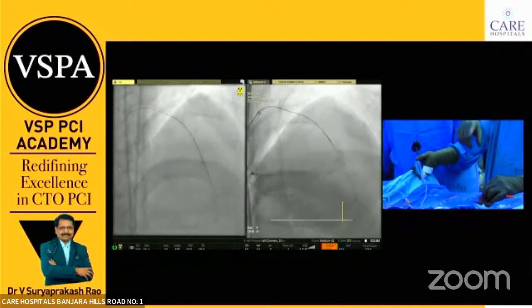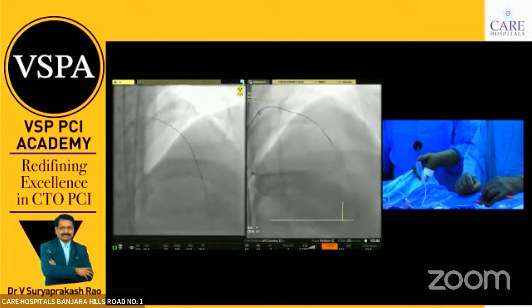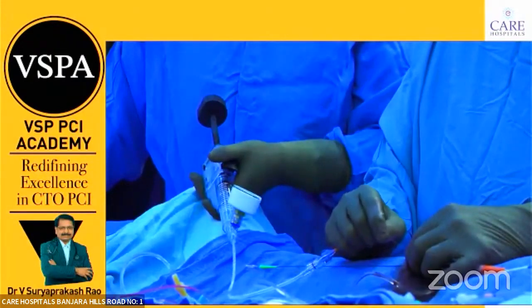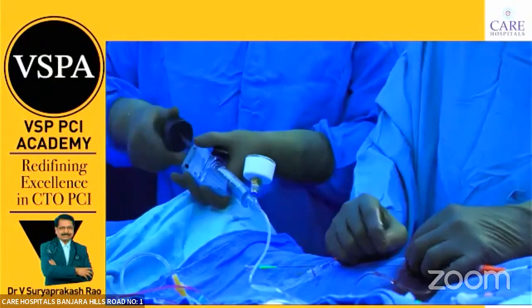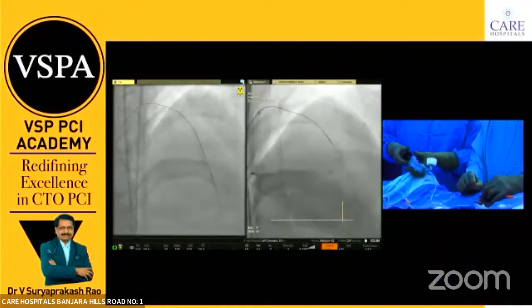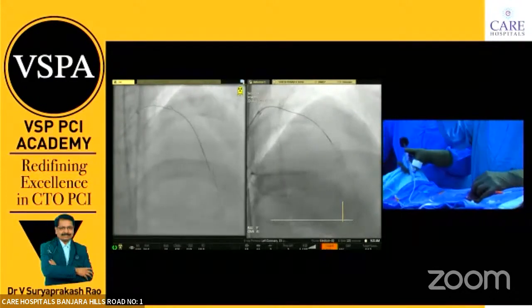Even now it is grade 2, no? Because, if you see, I hardly used any cine and fluoro, even then it touches grade 2. This is the problem when the patient is obese and you have to be careful with your machines. That's why we are now going for new machines which have less radiation. We have kept a rad pad here, which is supposed to absorb scattered radiation, and we'll dilate the proximal plaque. Show the proximal plaque, where is it.